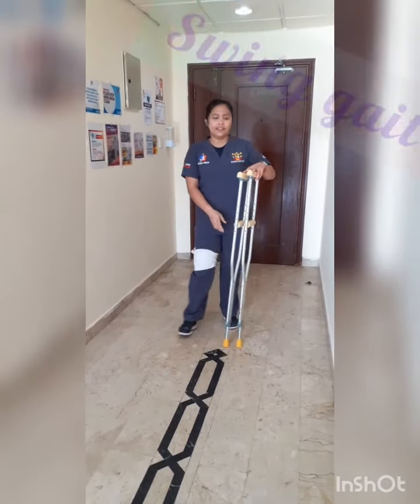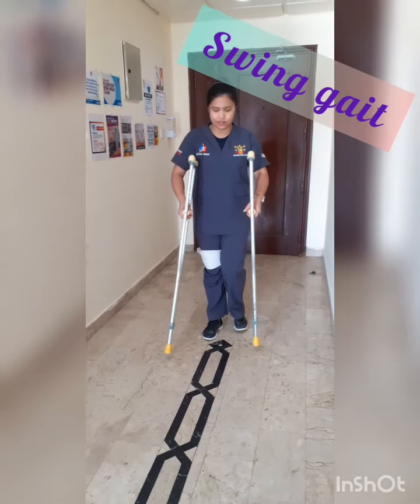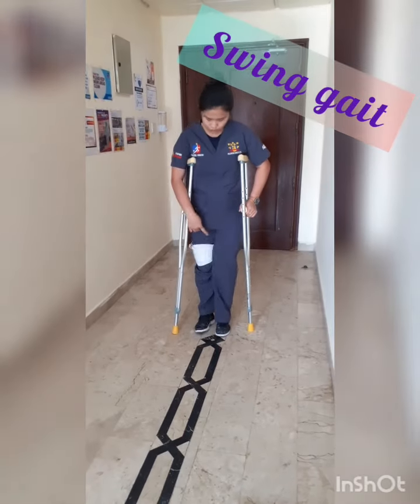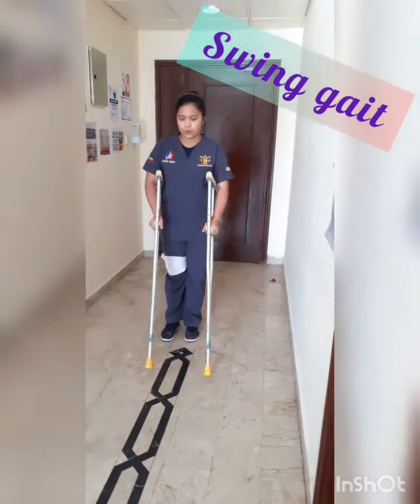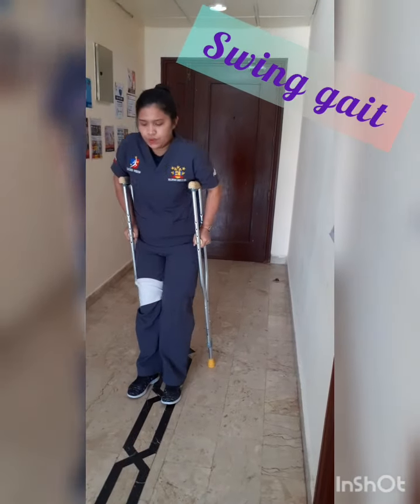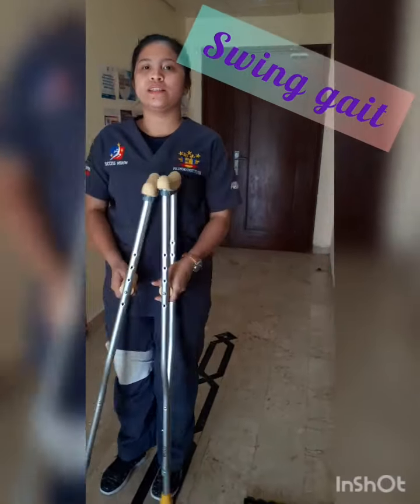The next one is the swing gait. You will move together — the 2 legs and this one together also: 1, 2, 1, 2. This is the swing gait.